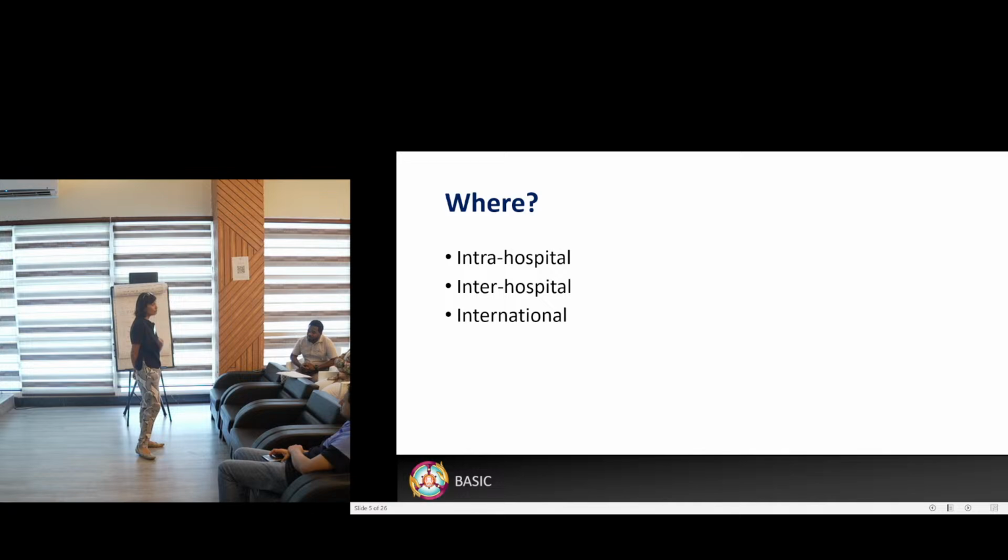I don't take one all the time, but if there's some patients, like this lady, I might take it in. Another patient who's otherwise relatively stable, or not even on inotropes, I might not take it. But in this lady, I might take it. So that has to come separately as well, because we don't have those monitors with defibs on them. Yeah, good. Anything else? Equipment-wise, great, okay. So, I think we've talked about all of those things.